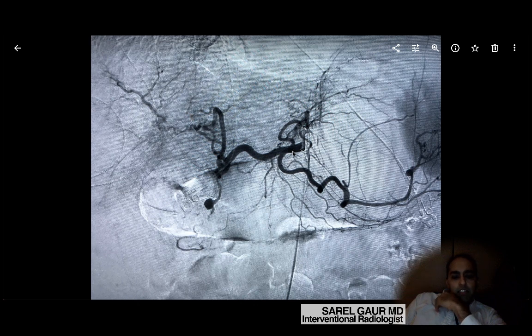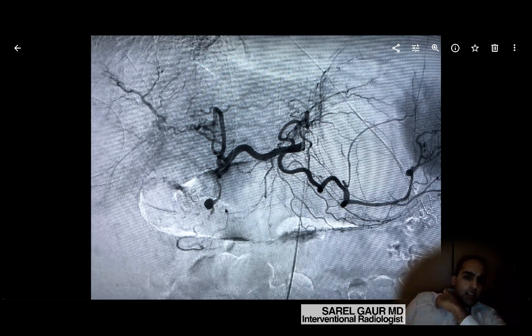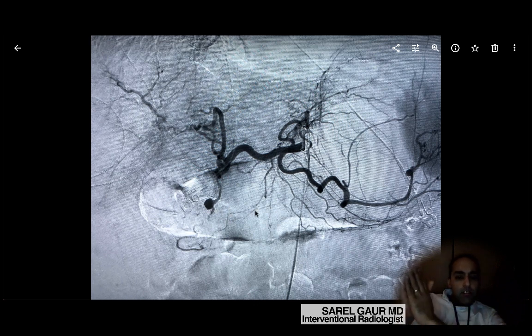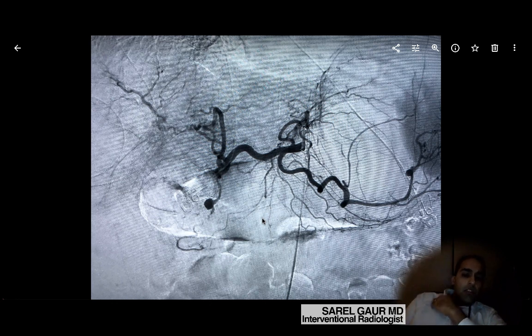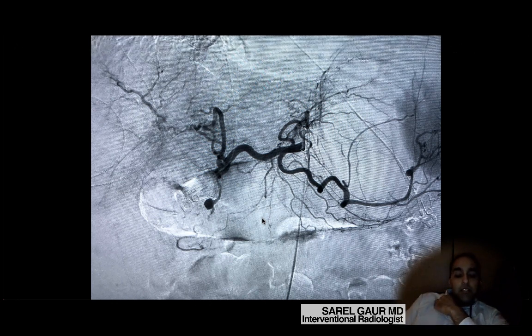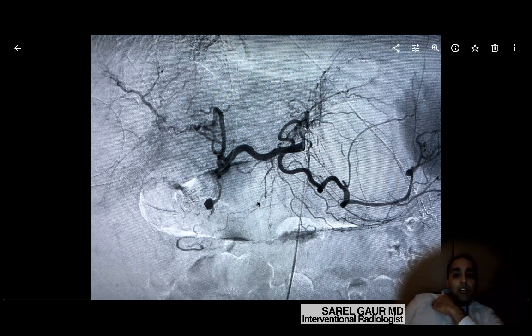As an interventional radiologist, my eyes go right here — this is an abnormal finding. This is the gastroduodenal artery, and as it comes down and around and supplies the inferior aspect of the stomach, there is this large contrast collection. You can see a thin vessel coming into it, and then it gets focally large right there. That basically has to be a pseudoaneurysm. Given the history of GI bleeding, this is really suspicious and is probably the cause of that bleeding. This is an unstable lesion.